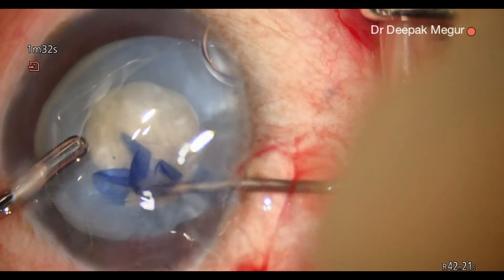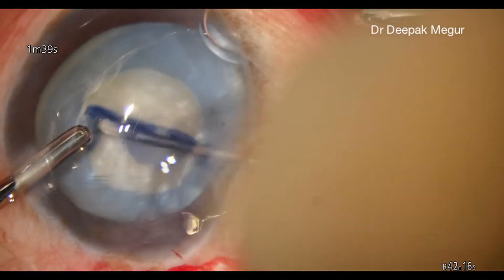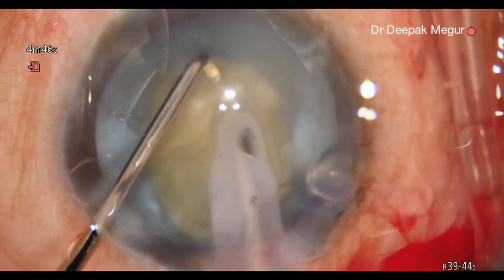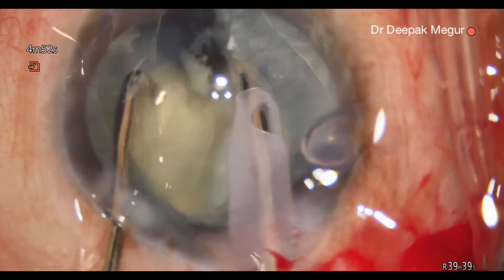Once the intracapsular tension is relieved, it's very easy to manage the anterior capsule and to attain a rhexis of an adequate size. It's important to note that the initial rhexis we aim for is quite small because it's easier to control.